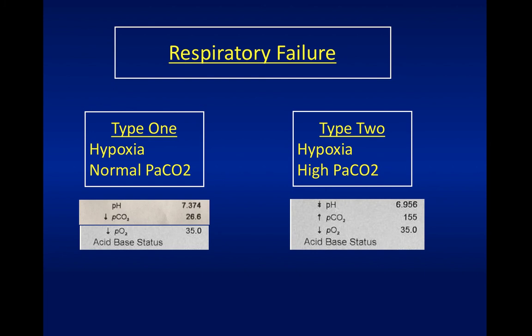Yes. I think probably the truth is it's hard for us to remember these. The best thing is to just describe what you see. So a hypoxic patient with a high PCO2, she's got ventilatory failure. There's a whole heap of reasons why that can occur. Some people describe that as respiratory acidosis, another way of describing it, isn't it? I mean, they can be mixed. So we'll talk about that in the next discussion.